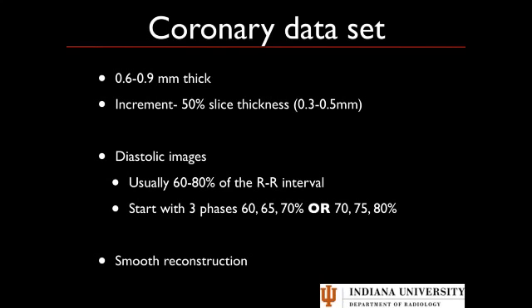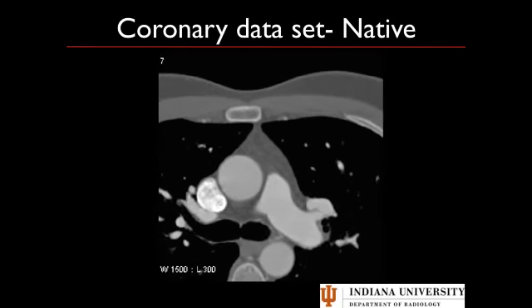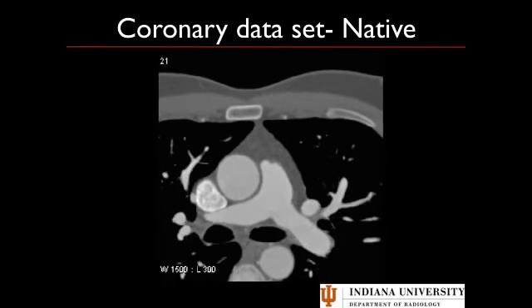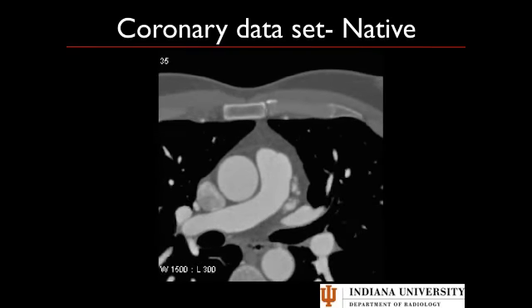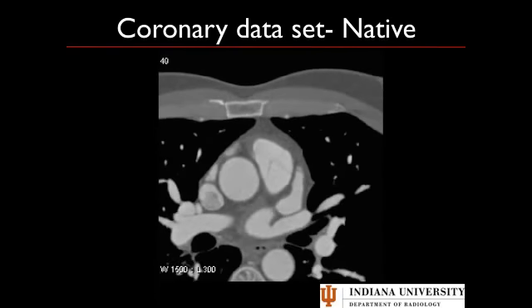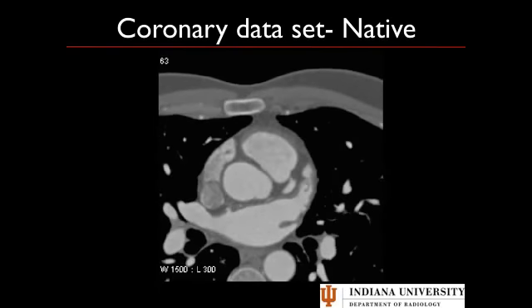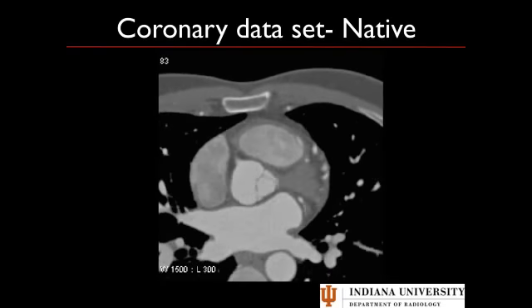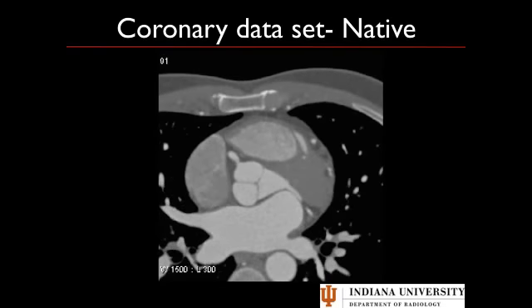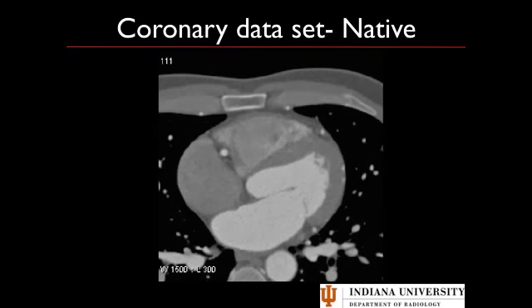Here's a native coronary artery dataset to give you an idea of what the images look like — relatively thin images with about a 50% overlap in the increment. You're going to want a relatively smooth kernel.